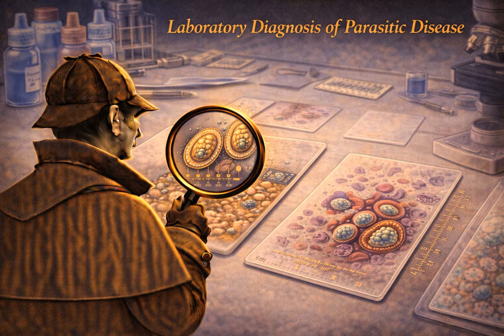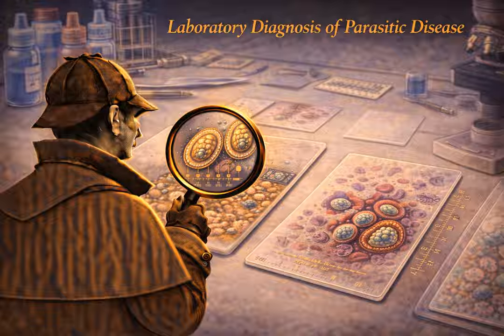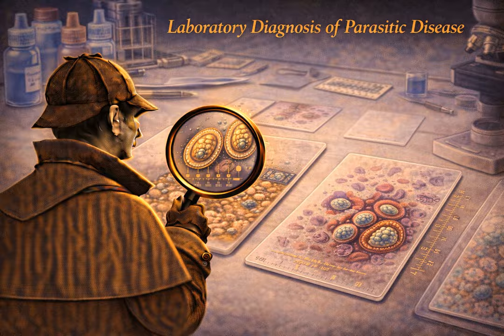And they look the same size? They are roughly the exact same size and shape. The critical difference between the killer and the bystander is in the nuclear chromatin, the physical pattern of the DNA arranged inside their nucleus. And you can only see that level of detail on a permanently stained slide. Correct. The trichrome stain is beautiful. It colors the background cytoplasm a soft blue-green, but it stains the nuclear chromatin a dark red or purple. That stark contrast allows the tech to clearly count the exact number of nuclei and check the peripheral chromatin ring. It is literally the difference between convicting a murderer and arresting an innocent bystander who just happens to look like him.